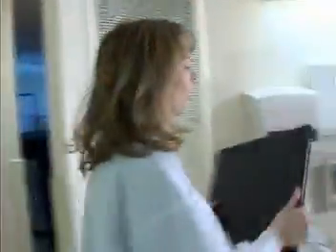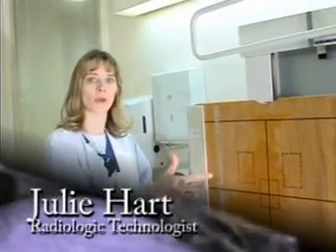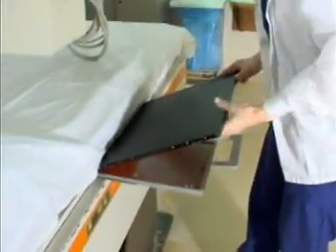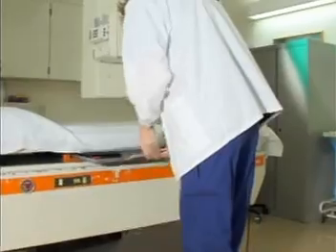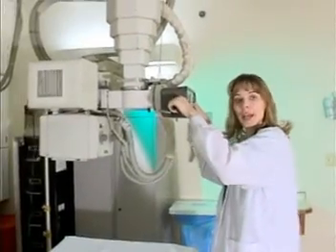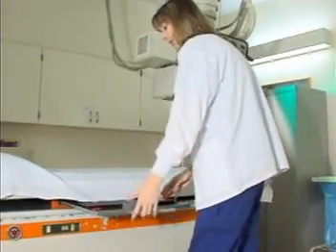We come in here to do the x-ray. We put our cassette right into the wall bucky here. These are for standing — for chest, for standing spine work, for skull work. And if the patient can't stand, then we bring them over here and put them on our table. Here we do hips, abdomens, pelvises. Sometimes we have to keep the patient in their bed and do their x-rays right there.